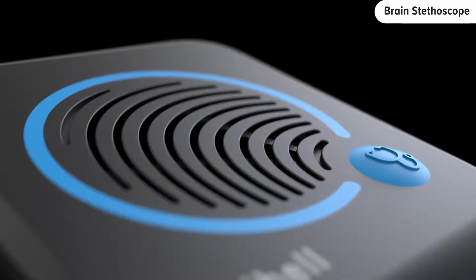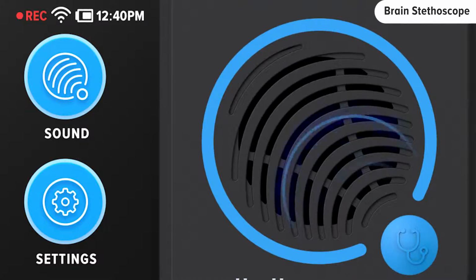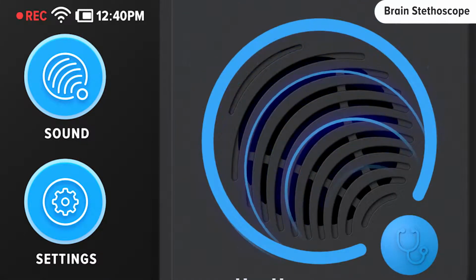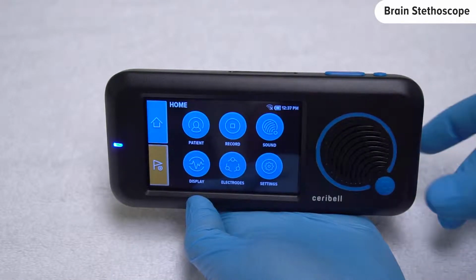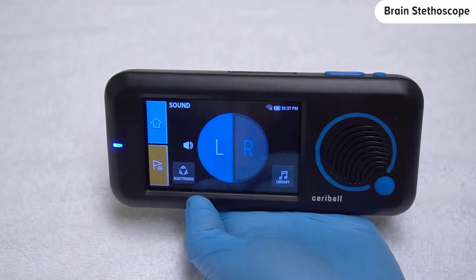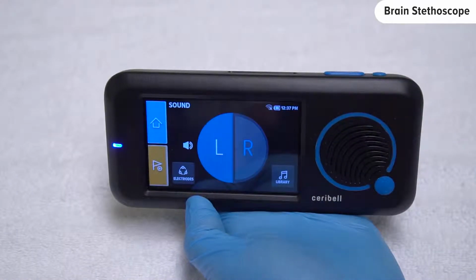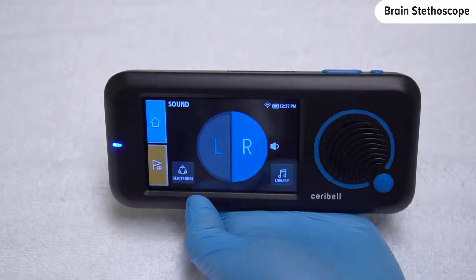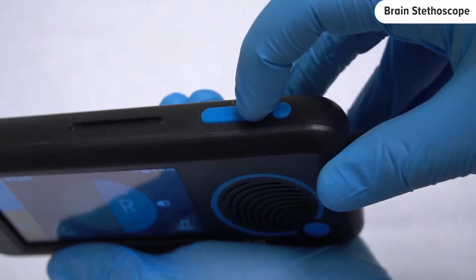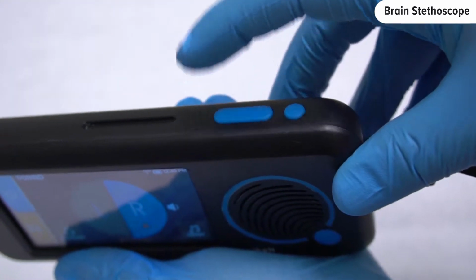The brain stethoscope is a feature developed by Ceribell to differentiate normal brain activity from seizures by converting EEG into sound. To use the brain stethoscope function, press the blue brain stethoscope button on the front of the device, or touch the sound button on the home screen. You can listen to either hemisphere of the brain by selecting left or right. To adjust the volume, press the plus or minus buttons on top of the recorder.